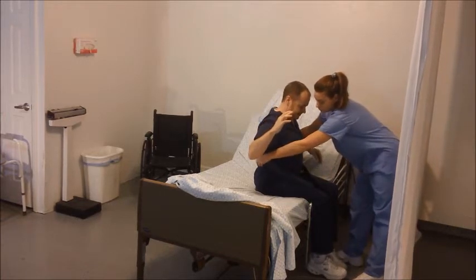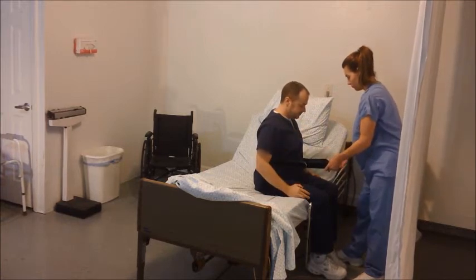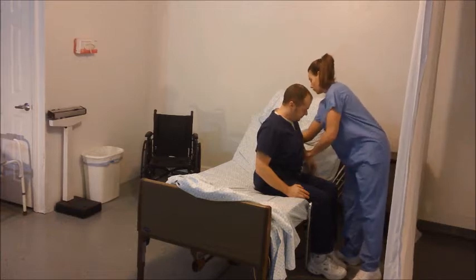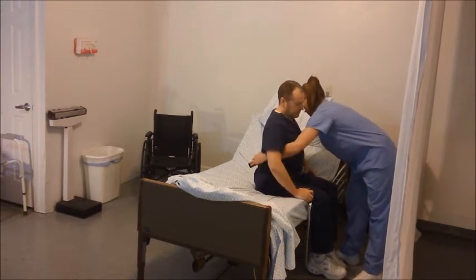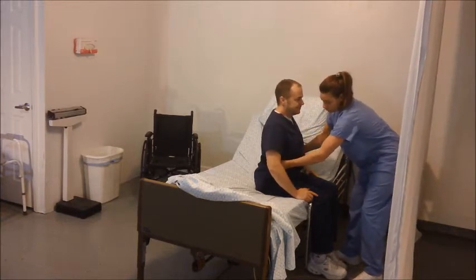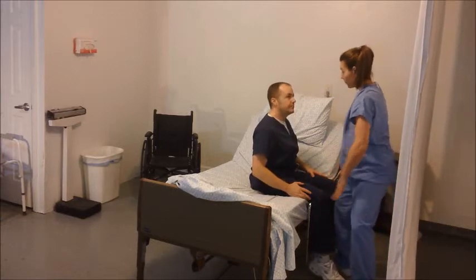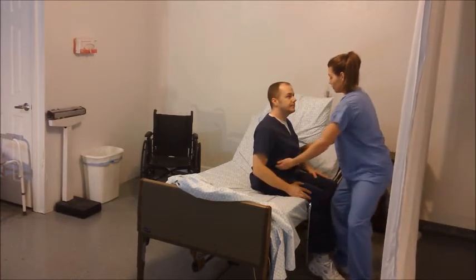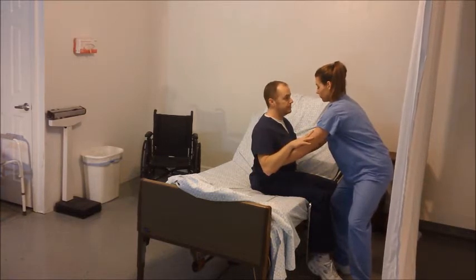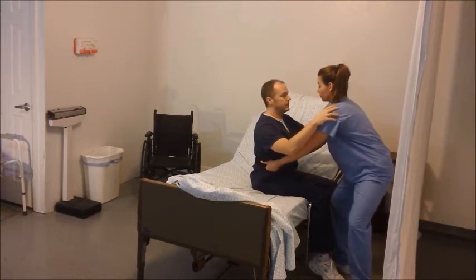Ask about how resident feels during ambulation. Walk resident at least 10 steps. Assist resident to turn and have back of legs positioned against seat of chair before resident sits. Provide support to sit resident back into chair. Remove transfer gait belt from resident's waist without harming resident. Example, pulling transfer gait belt when seated in chair after ambulation.